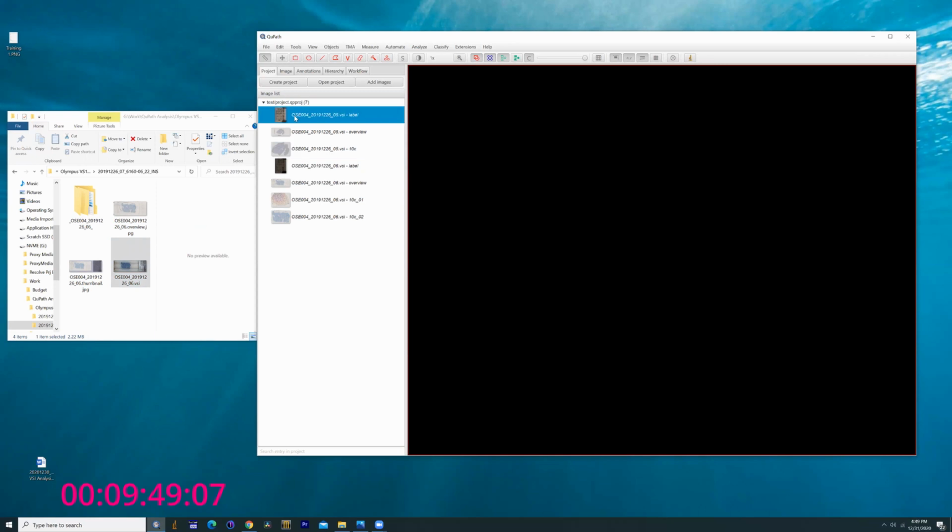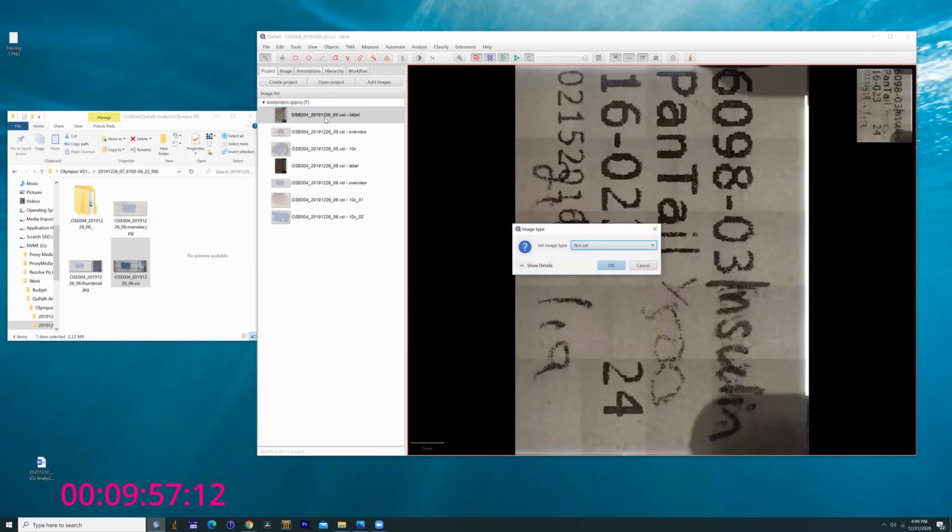One quick thing, we can hit save real quick. It actually already has saved this file, but basically, what I recommend doing when you first pull the files in is going through and just checking on the information coming in.